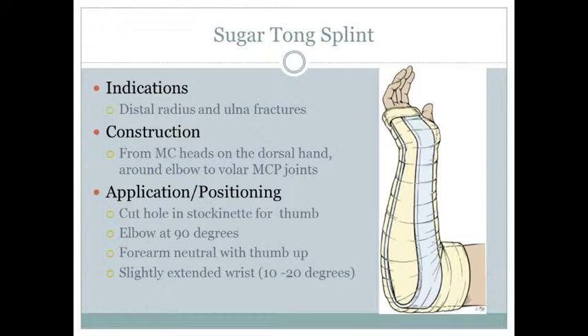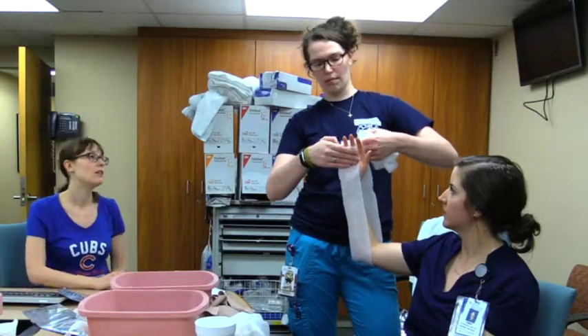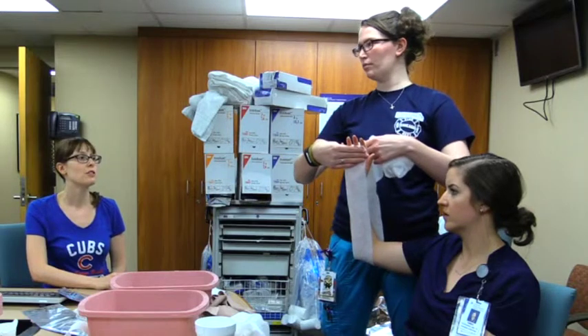So you're going to measure from here, around the elbow, back up to there. That's for any kind of wrist fracture.